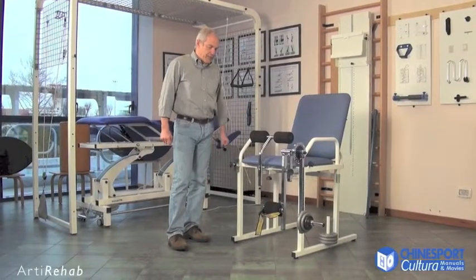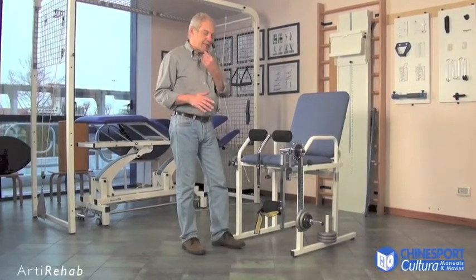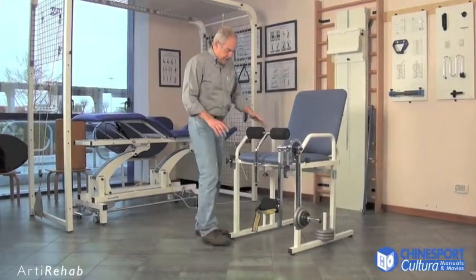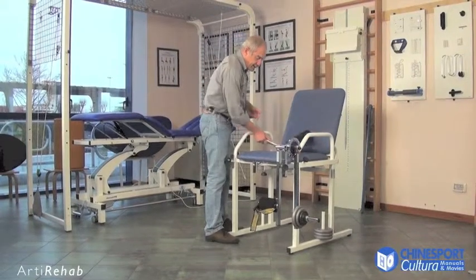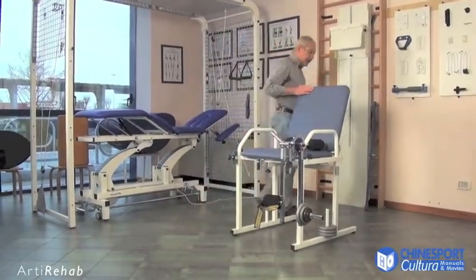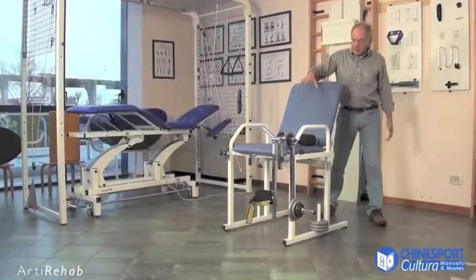RT Rehab is a machine used to strengthen the lower limbs in terms of both extensor and flexor muscles. It is made up of a chair that is easy to use even for those that have difficulty moving. It has a reclinable backrest which makes it possible to position the patient correctly.